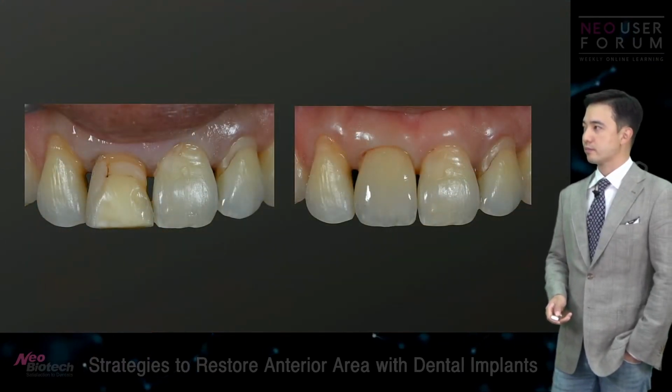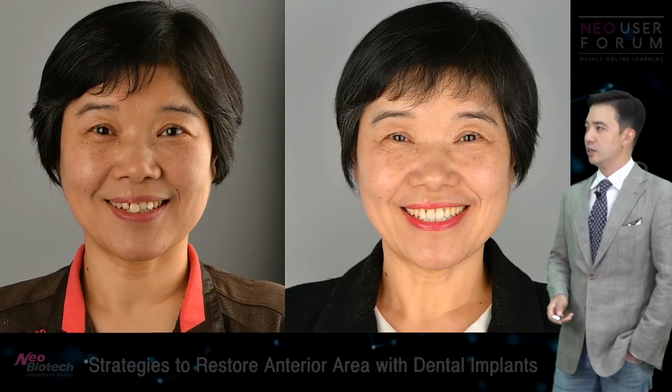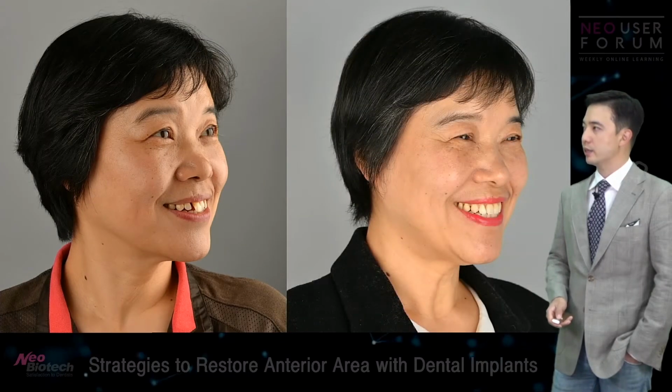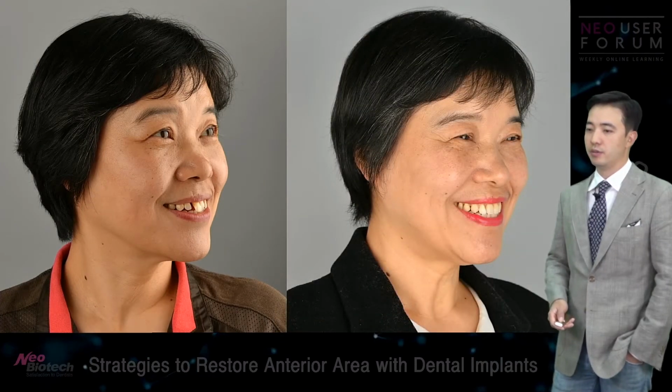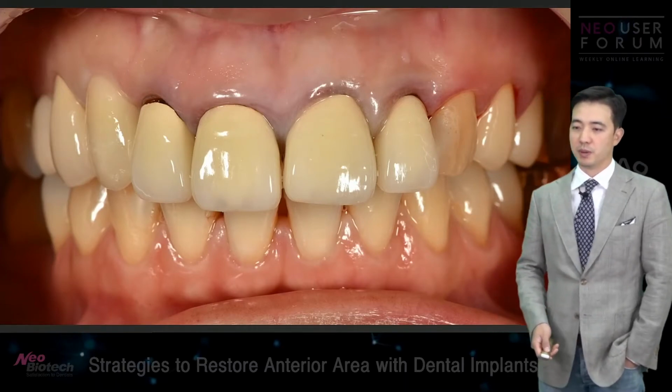So yeah, from here to here, I think this also took about a year, this case, but it was really worth waiting. The patient didn't really suffer from any kind of big surgeries, but ended up having that beautiful smile.